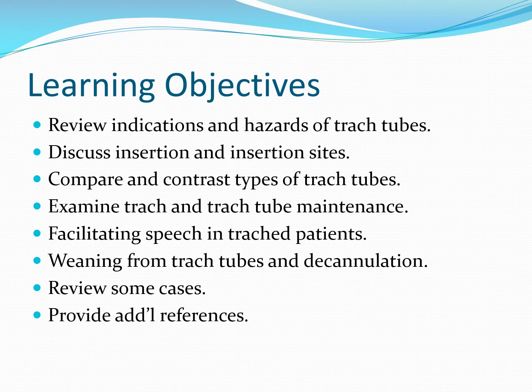We'll discuss the insertion and insertion sites. We'll compare and contrast the types of trach tubes. In addition, we'll examine the trach and trach tube maintenance. So that would include maintaining the stoma, making sure that it's clean, making sure that it doesn't appear infected.